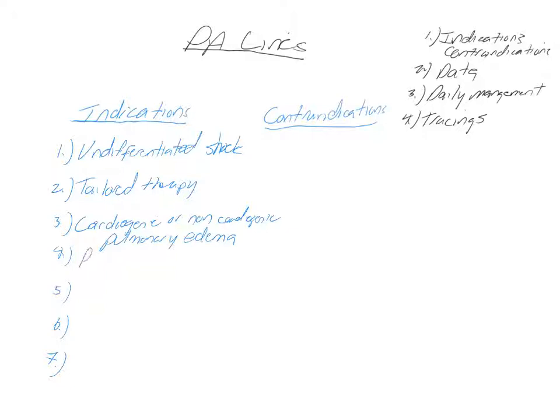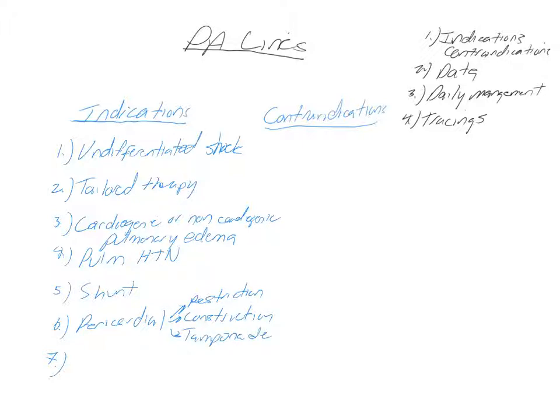They're useful in understanding the severity and etiology of pulmonary hypertension, in teasing out the presence of a shunt, in evaluating pericardial processes, and that's notable for restriction, constriction, or even regionalized tamponade. And lastly, they could help us understand the severity of valvular disease.